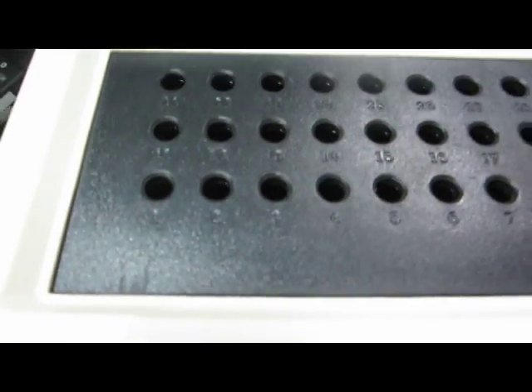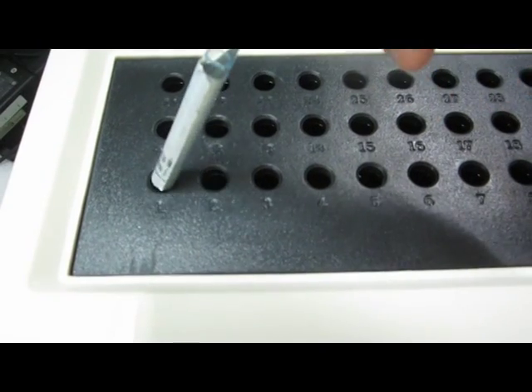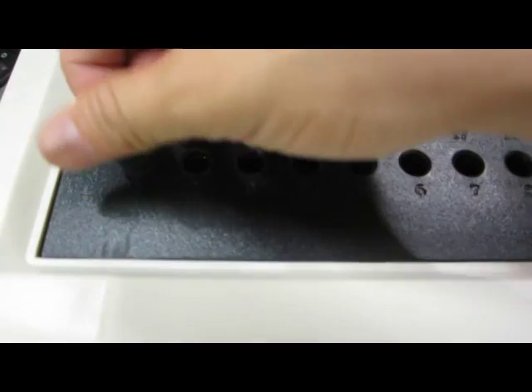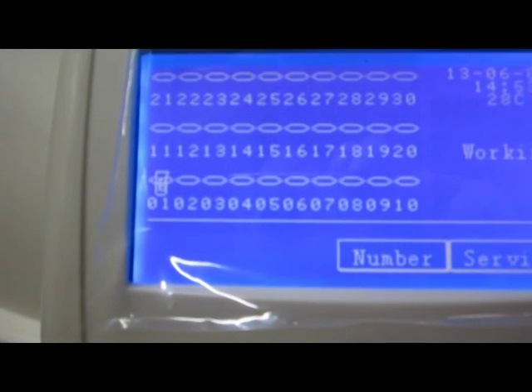After setting, we can put the tube inside the channel, inside the hole accordingly. Then the tube icon shows on the screen, which means channel 1 was programmed and ready.